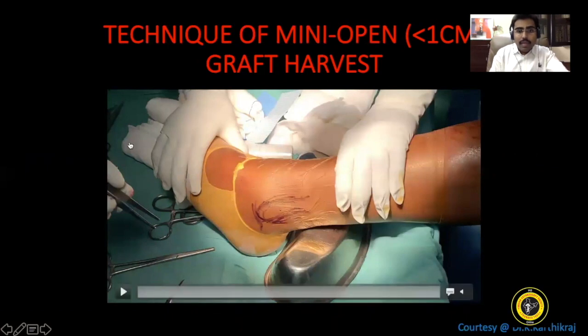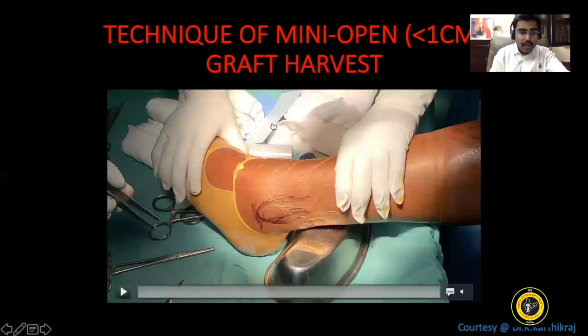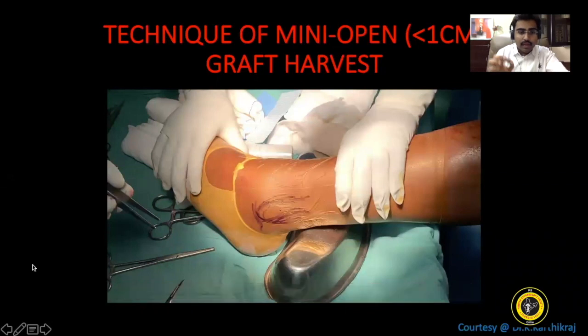Now, this is a mini-open technique that I follow, where the incision size is very less than 1 centimeter, hardly 7 to 8 mm. Now, to make it very clear, the size of the incision is definitely not important. The more important is the functional outcome. But as our learning curve goes through, it gives us a better understanding of the anatomy, thereby helping us to get the tendon harvesting done through a very small incision, causing less trauma, better pain relief, and earlier patient rehab and back to play.